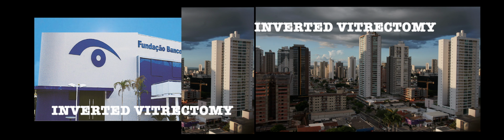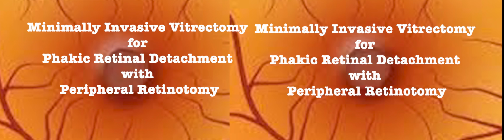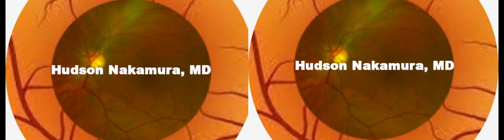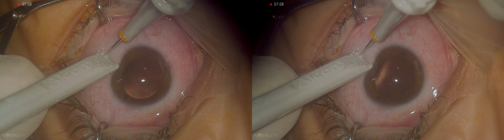This is inverted vitrectomy. Minimally invasive vitrectomy for phakic retinal detachment with peripheral retinotomy. The patient is phakic and the lens is pretty clear.